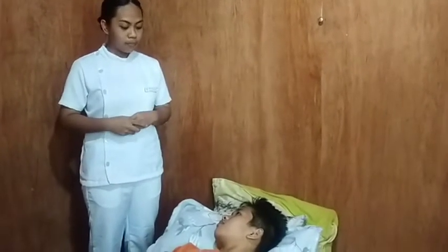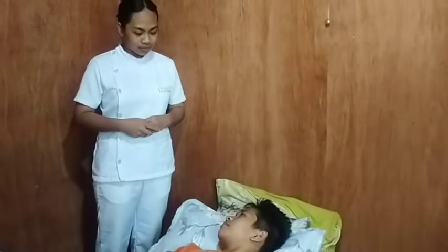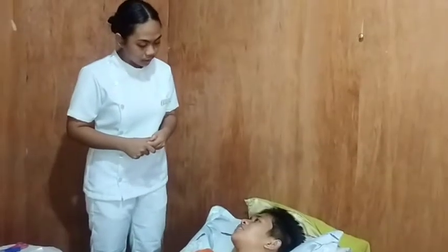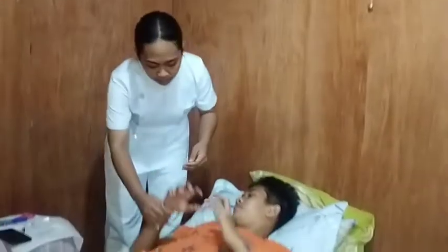Implementation. Greet client, introduce self, and explain procedure in the client's level of understanding. Sir, unsay imong pangalan, sir? Yes, ganyan kagama po. Identify client using at least 2 identifiers.